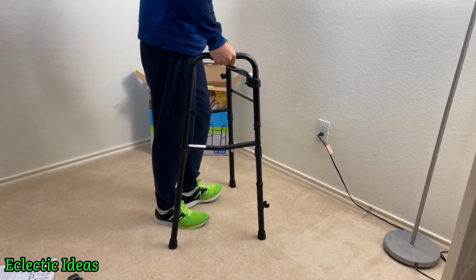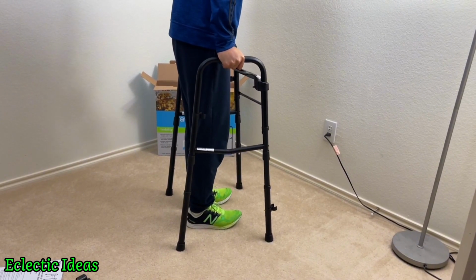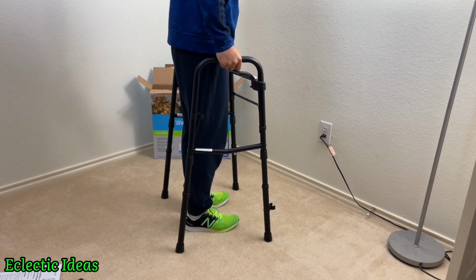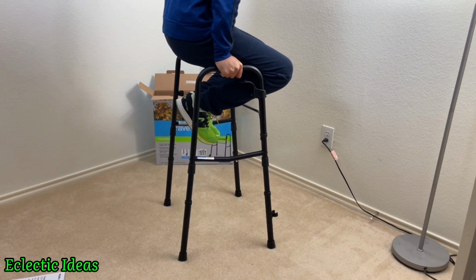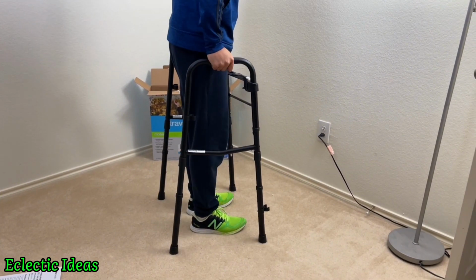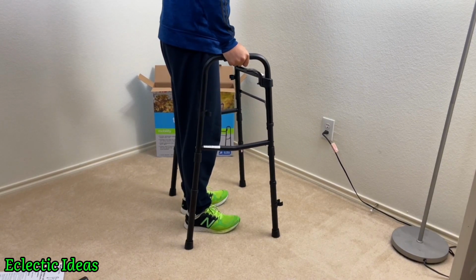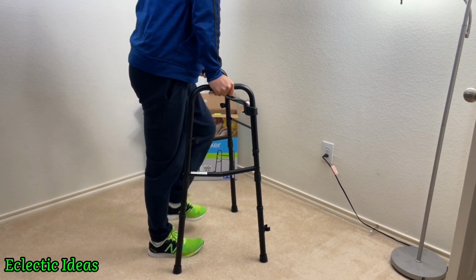Do assess your abilities though and get to know it. Try to stay vertical. Don't get too far out. Don't lean too much. And take your time. We don't recommend doing this at home because it's not a home gym, but the cross brace did hold him up while he put his legs on top. And we would ask kids not to mess with their parents' or grandparents' mobility devices, or you could slip and you may need one of them. So be very careful with this.